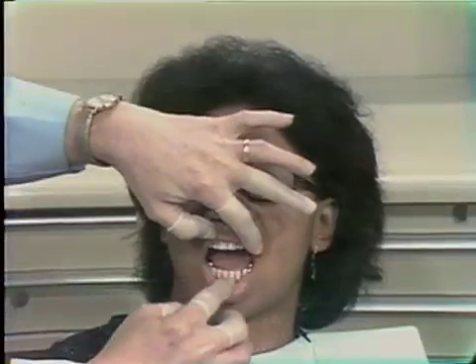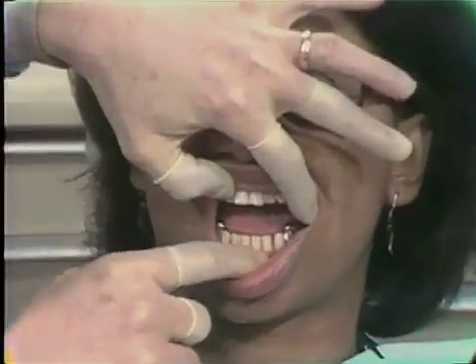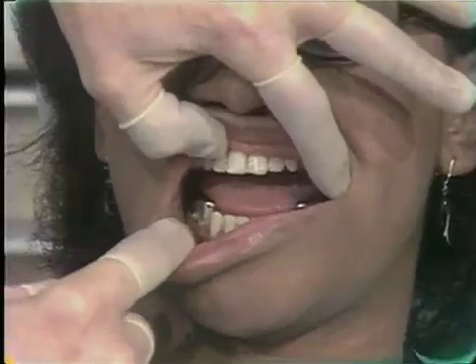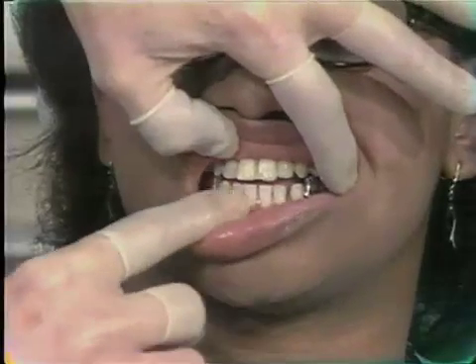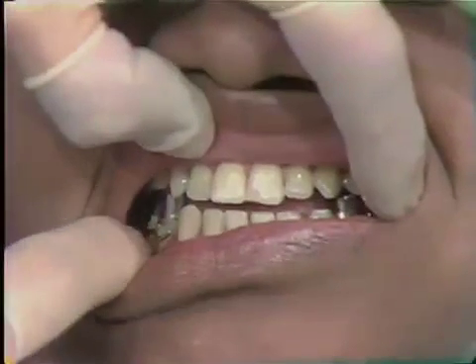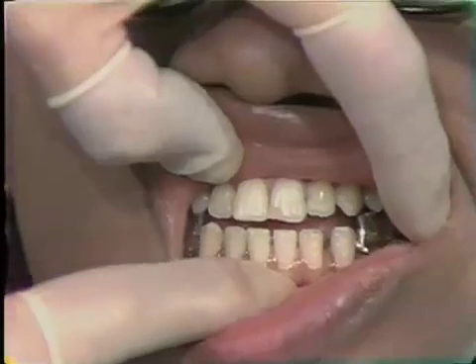When you observe the patient, you can see inter-orally that she has a rather large metal appliance, and when she closes her teeth together, there is anterior separation of the teeth. So there has been a significant increase in the vertical dimension.